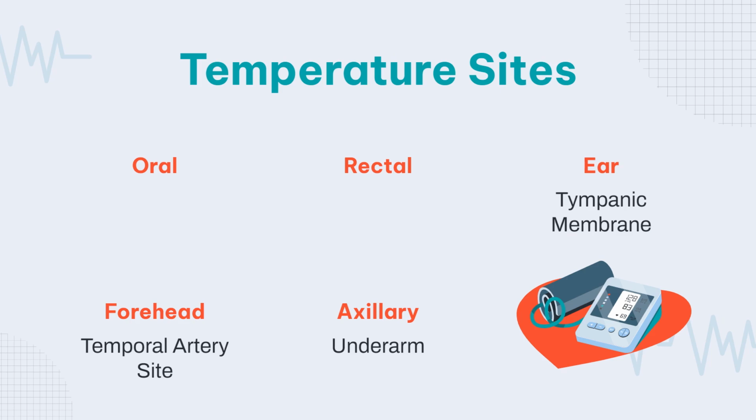Next, the rectal site is used for infants and children under 3 years of age. Rectal temperatures are not taken if the person has diarrhea, has a rectal disorder or injury, has had rectal surgery, or if the person is agitated or confused.